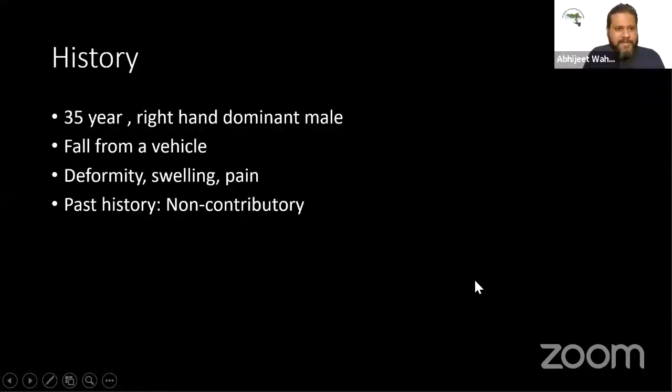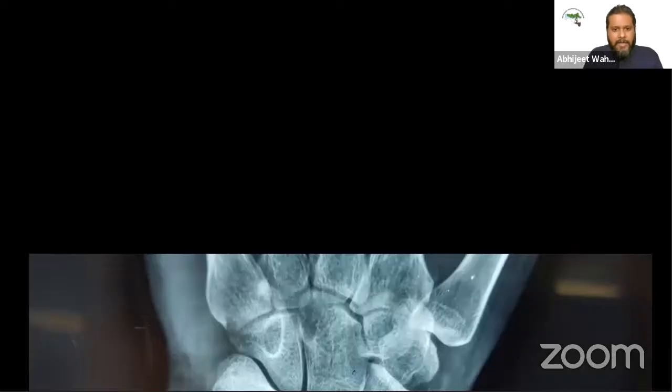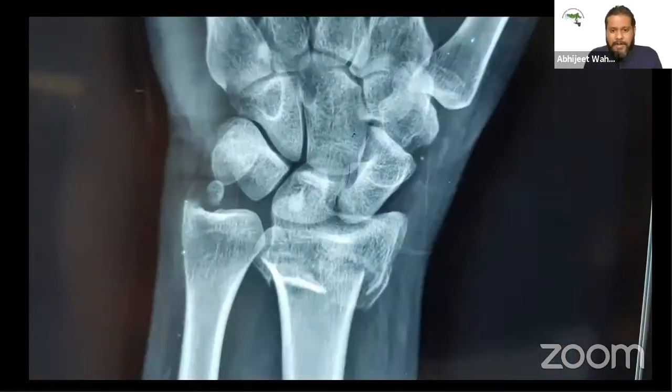Okay. So this is a 35-year-old right hand dominant gentleman who had a fall from vehicle, presented with a deformity, swelling, and pain. The past medical history was non-contributory, and he's a non-smoker. So this is a fresh case that presented to the clinic. And this is the posterior anterior view, and then this is the lateral view. I could go back to the posterior anterior view, and I would like to pick on the panelists' brains to share with us what is it that we glean from these two x-rays, any further investigations required, and what would be the management.